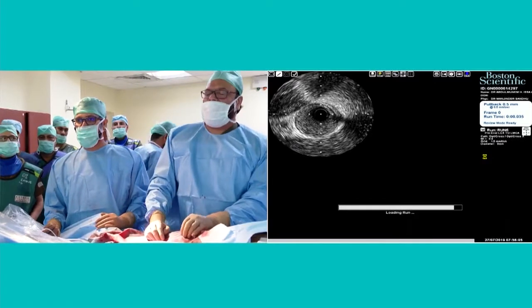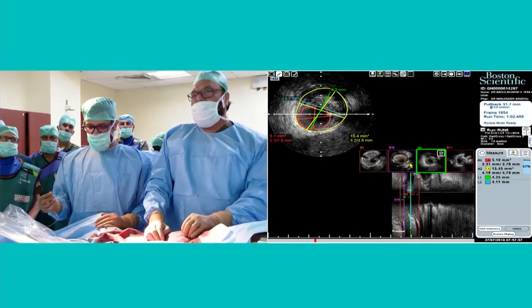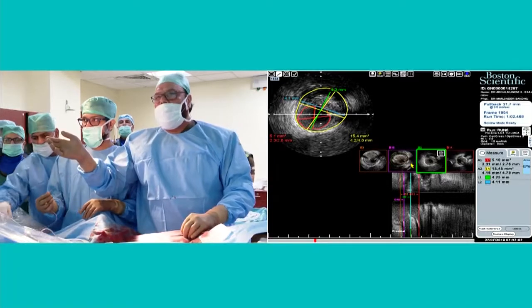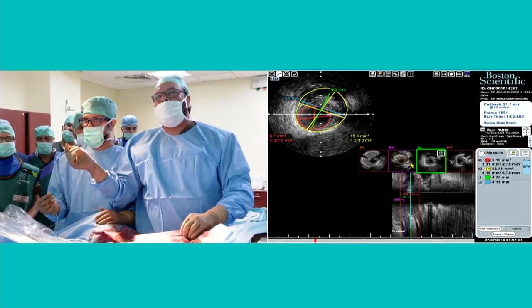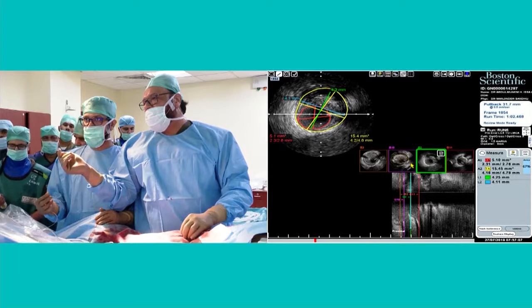We are planning a TAP, a T with minimal protrusion. TAP is perfectly fine in that situation. Are you planning any debulking strategies too, like cutting balloons or rota?